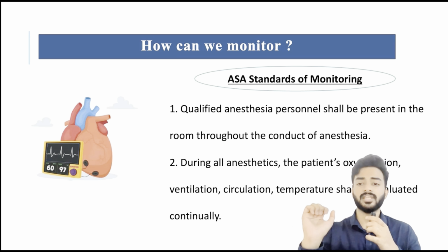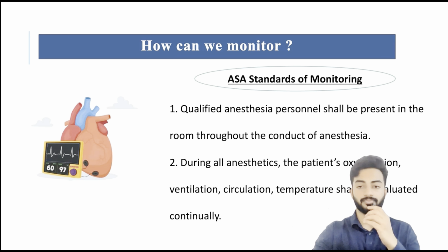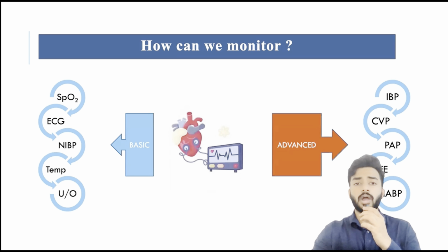In the ASA definition, they have given the minimum experience as 3 years for that personnel. So a post-MD anesthesiologist should be present inside the OT, that is standard 1, and the patient's oxygenation, ventilation, circulation, temperature shall be evaluated, that is standard 2. So how can we monitor?